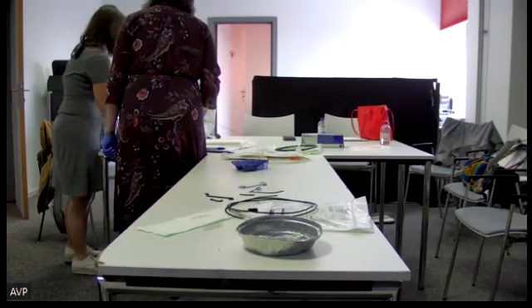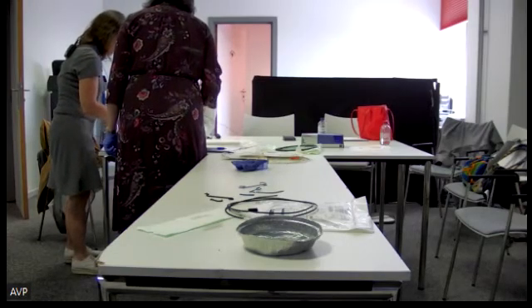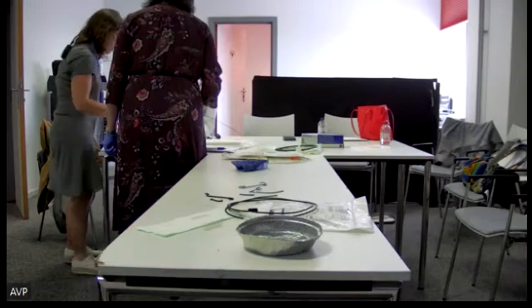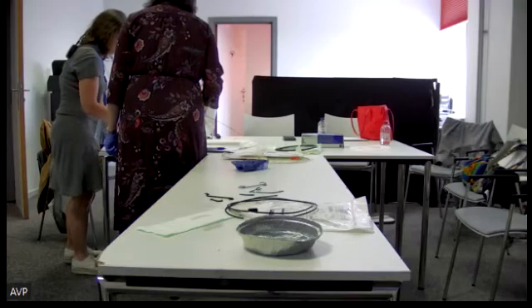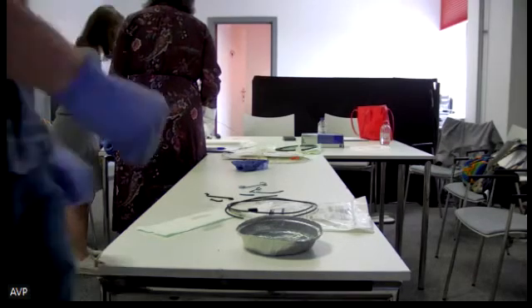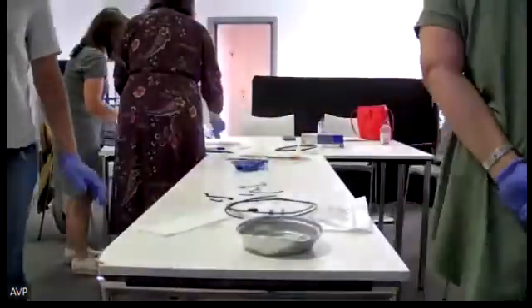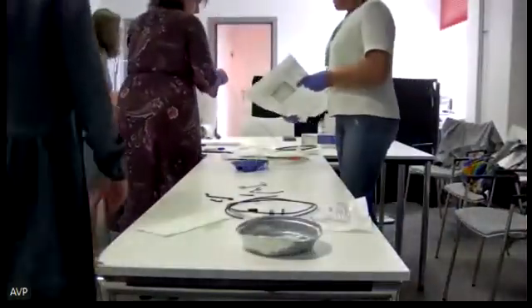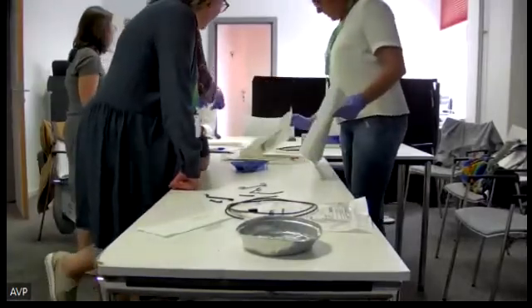With this system, we don't need a pathologist in the room anymore. This is an FNA needle, but with the FNB needle, we don't need a pathologist in the room. Very often we don't have enough tissue. With FNA, you do 3-4 passes, or you do 2 with FNB and you have more tissue.